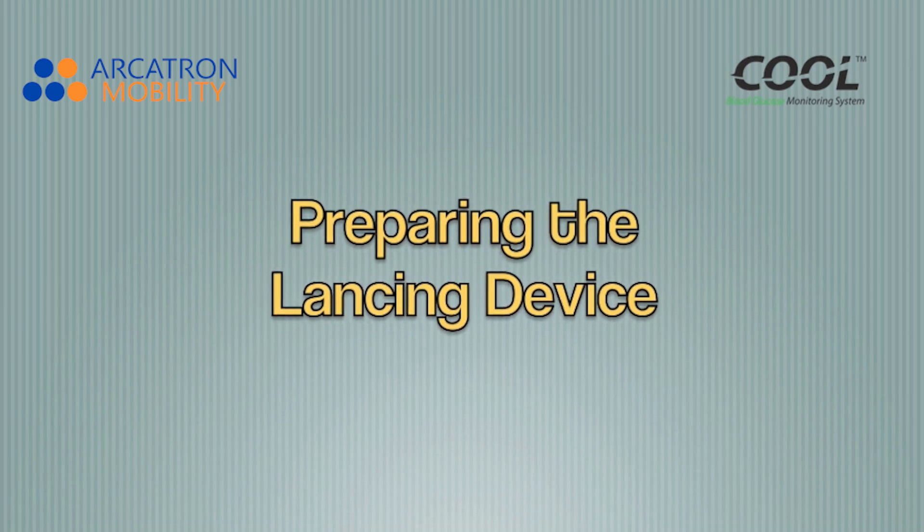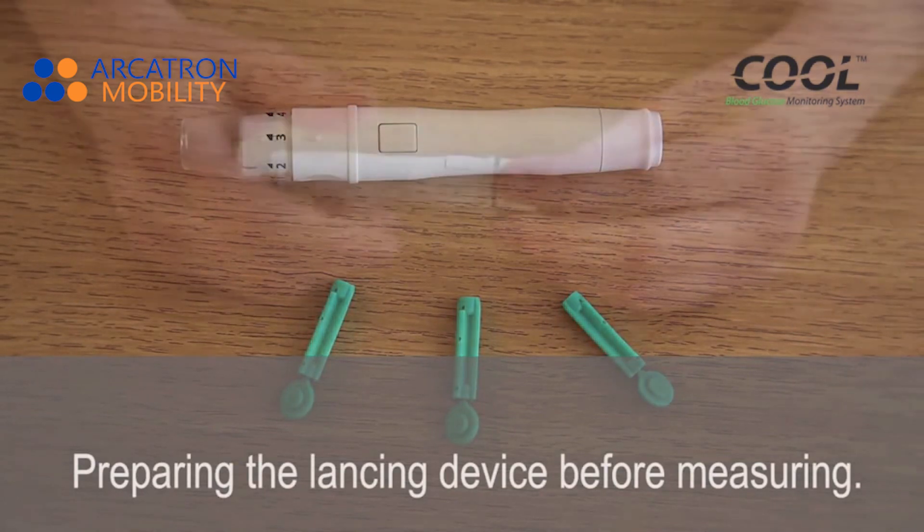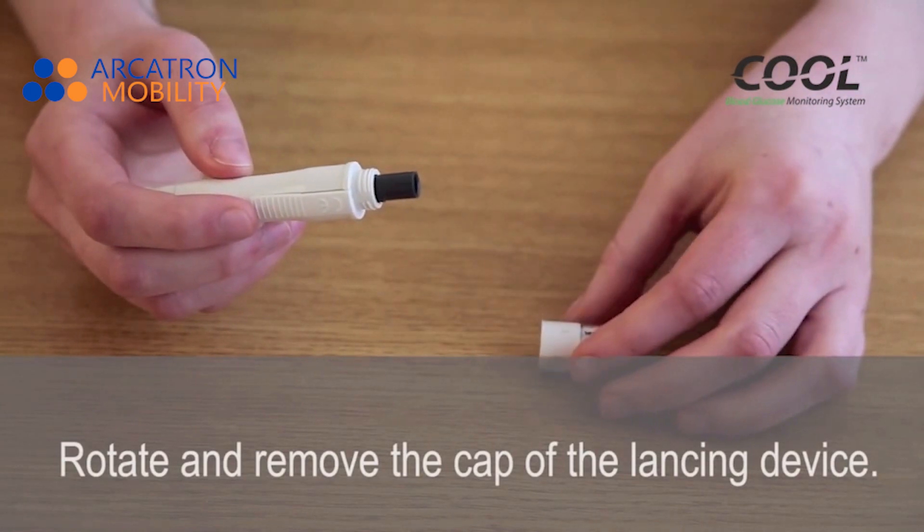Preparing the lancing device before measuring. Rotate and remove the cap of the lancing device.